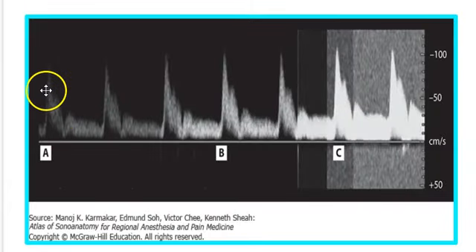And here we can see where we have undergained. Increasing our gain a little bit here, we can see this isn't a bad window. This is probably pretty good spectral. Here, let's overgain. See how the gain is filling in the image here. The gain is too high here.